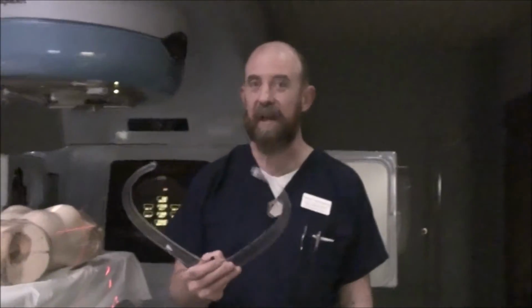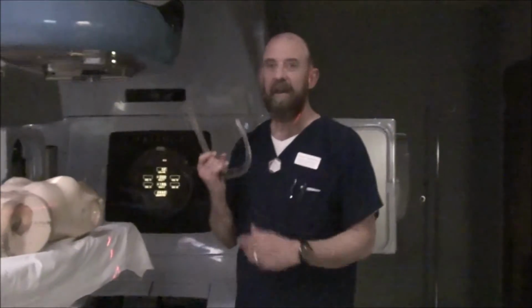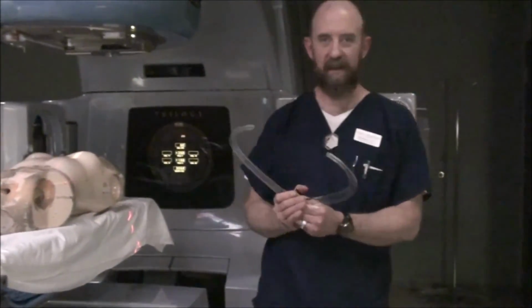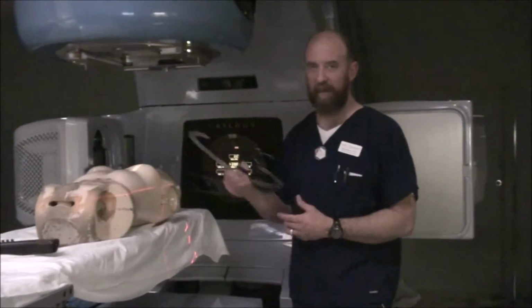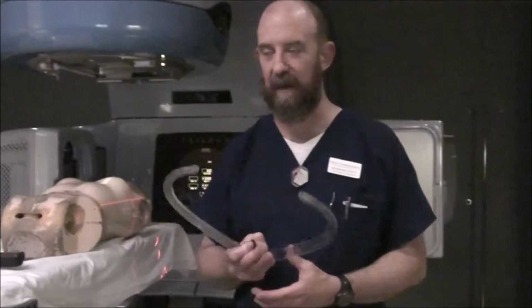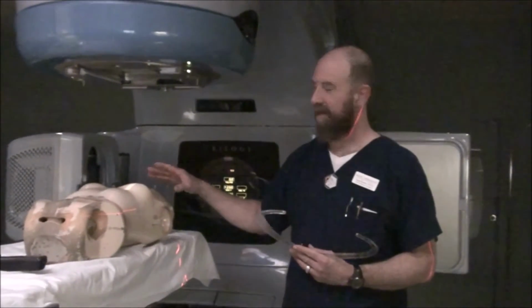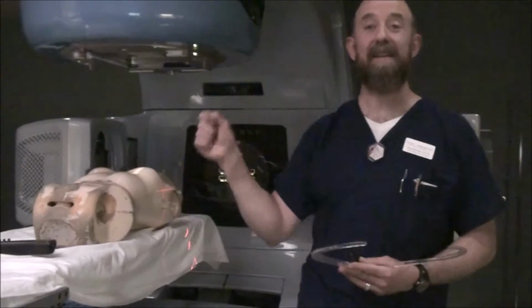I did this out of order. This is something you should do before you take your x-rays. When you're at your medial, and when you first put your wires on, take your separation then. I'm sorry for having this out of order. Take your separation before you take any of your films at all. Make sure that you've got your isocenter set correctly. Okay? So set your SSD where it's supposed to be and then start taking films.